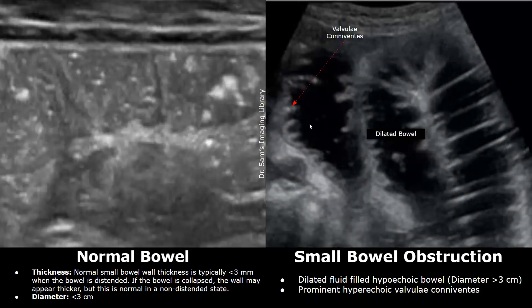This is another case of small bowel obstruction with dilated hypoechoic fluid-filled bowel. The diameter was greater than three centimeters, and you can also see prominent hyperechoic valvulae conniventes — the hyperechoic prominent intestinal folds.